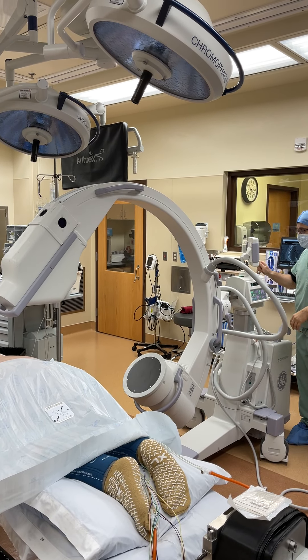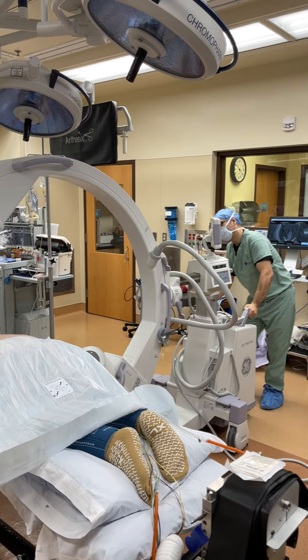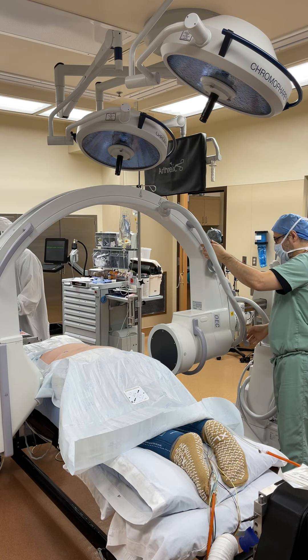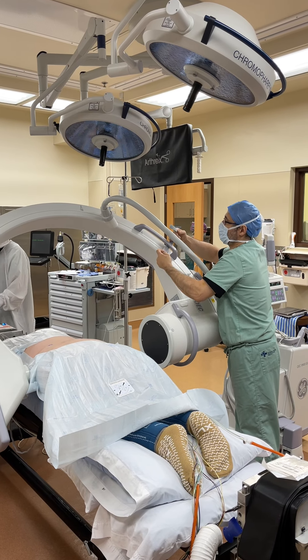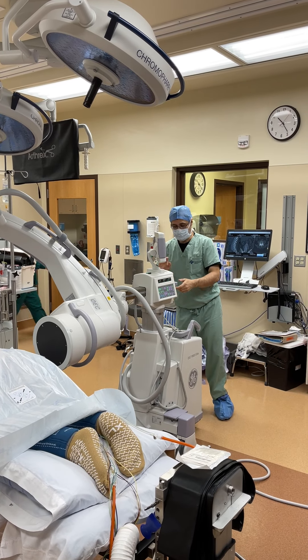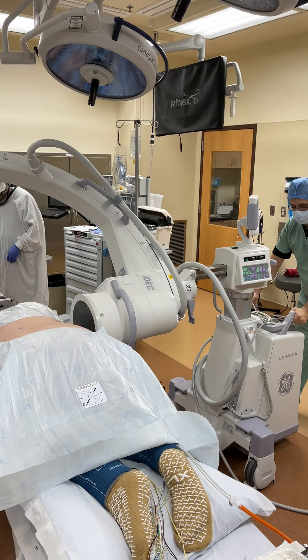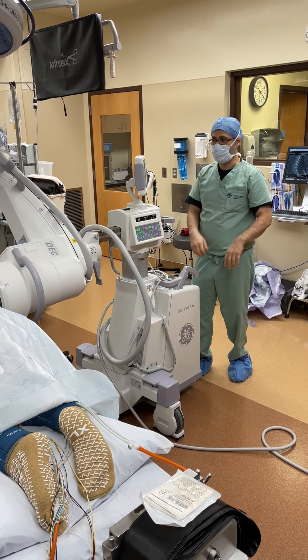I will first maximize the slide, then go all the way in. The tilt goes at about 150 degrees, and we put a Velcro so that this is not a smooth operation. First step: maximize the slide, then literally go touching the patient. Then we make the wheels parallel to the patient and slide it back two inches so we can use the other actions.